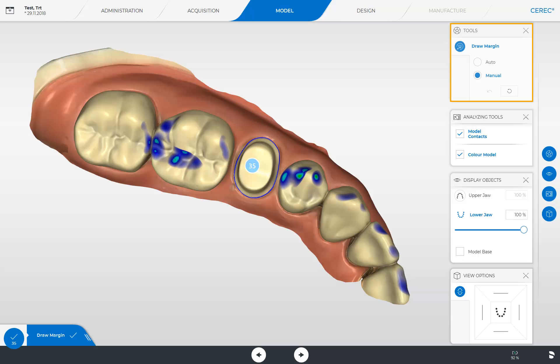Since the CEREC software has already automatically drawn the margin ideally, we won't make any modifications. Below, the array of analyzing tools is displayed. To disable the two functions, remove the blue checkmarks.